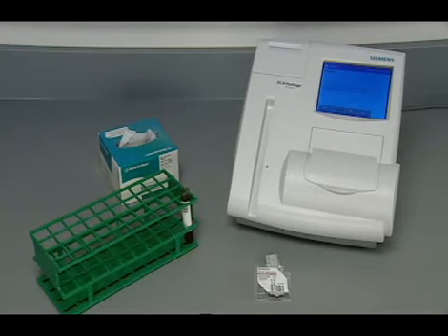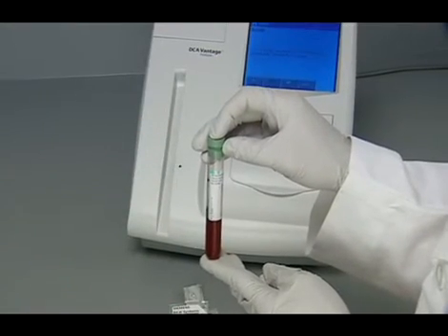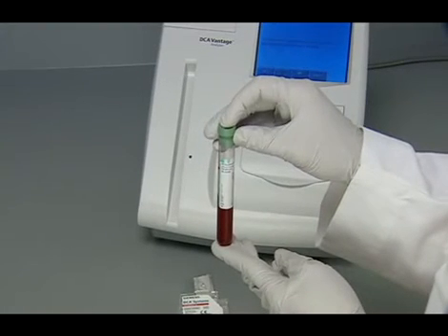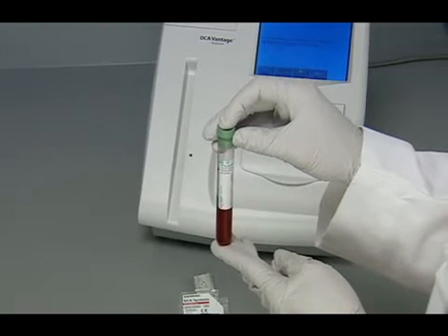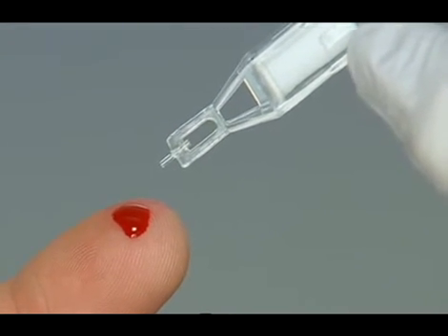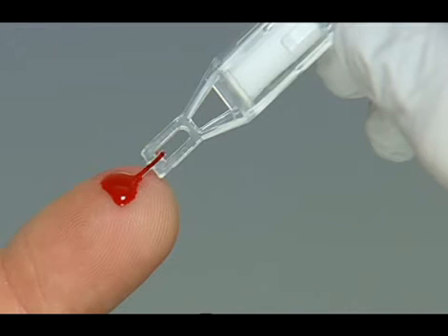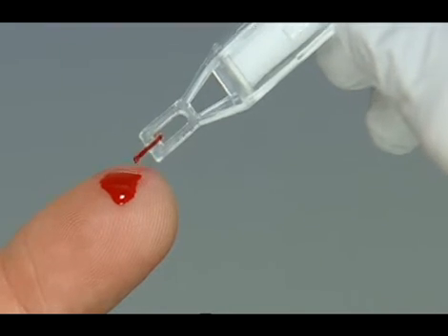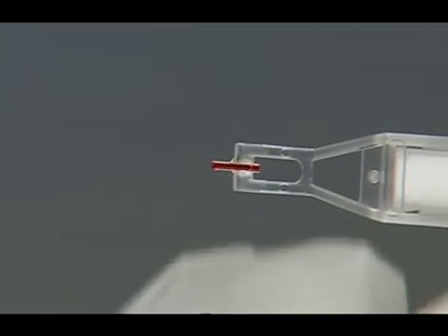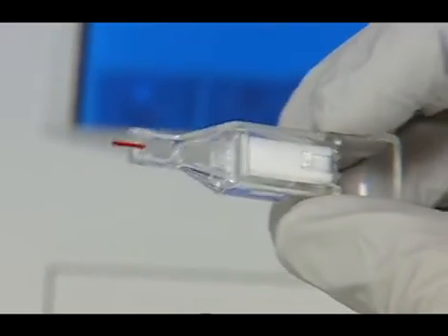Now you will fill the capillary with patient sample. Once the capillary is filled with the sample, analysis must begin within 5 minutes. The blood sample can be from a finger stick or a venipuncture. One microliter of blood is required to fill the capillary. For capillary blood from a finger stick, hold the capillary holder at an angle and touch only the tip of the capillary to a small drop of blood on the finger until the capillary fills. Using a lint-free tissue, carefully wipe the outside of the glass capillary. Inspect the capillary for any bubbles and discard if present.